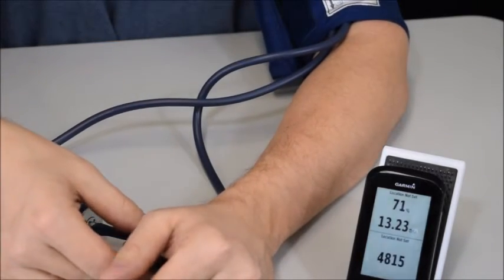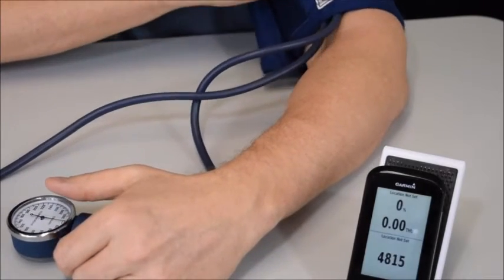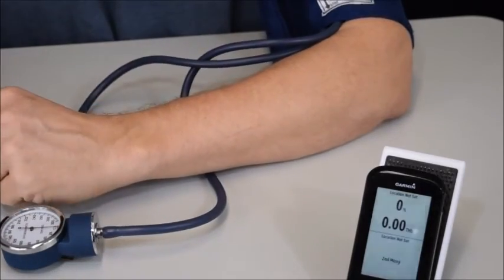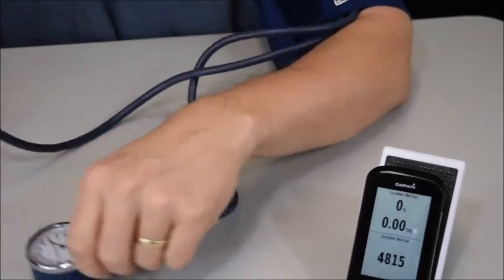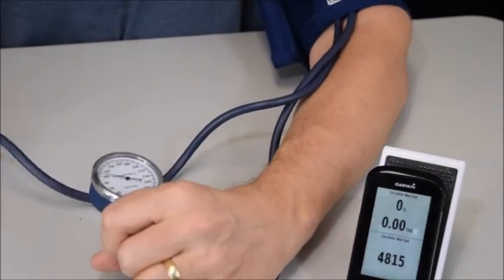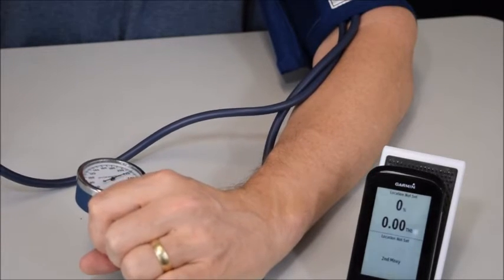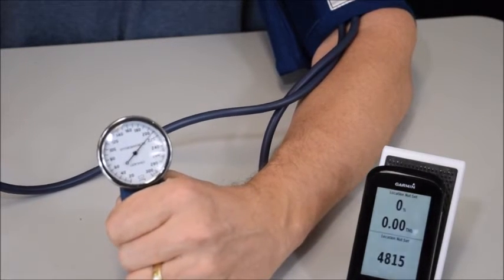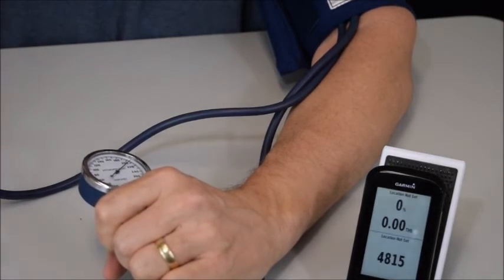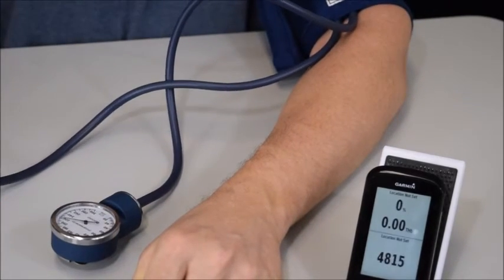And now what we want to do is to try and exemplify this issue. I've got a blood pressure cuff. I'm going to use it as a tourniquet on my upper arm, and so I'm going to go ahead and inflate this. Somewhere 220 or so, so we're for sure getting a good occlusion going. And then we're just going to let me rest for a little bit. Make sure you keep this inflated.